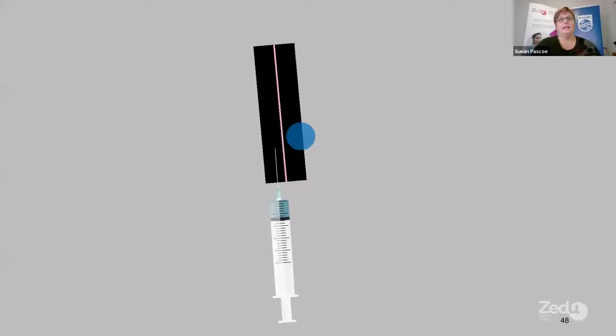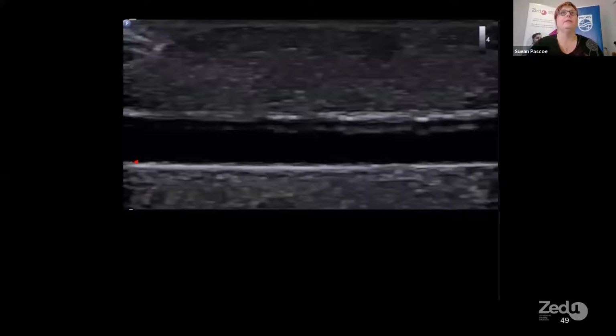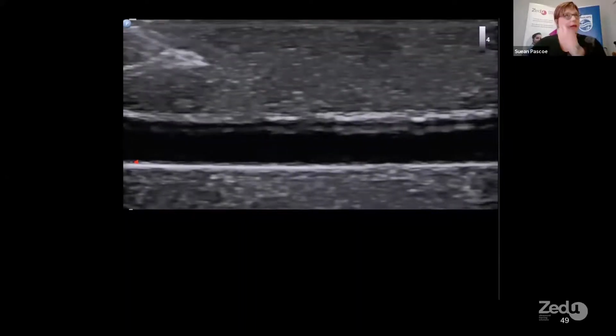So typically in an in-plane approach, you should find your target, and that's the lineup of your probe, and then your probe doesn't move. You have to put your needle into the path of the ultrasound beam. Once you start getting the needle in, if you've gone crooked, it's not going to help. So pull out, start again, line up the anatomy, get your vessel or your target in view, keep your probe very still, and then you put your needle into the path of the ultrasound beam. So here's that in-plane approach again.